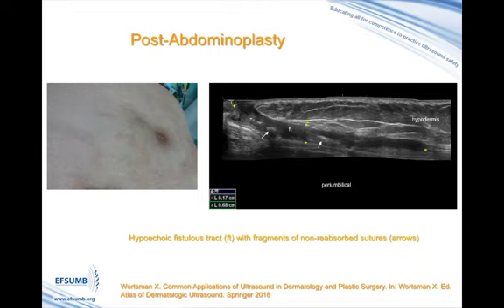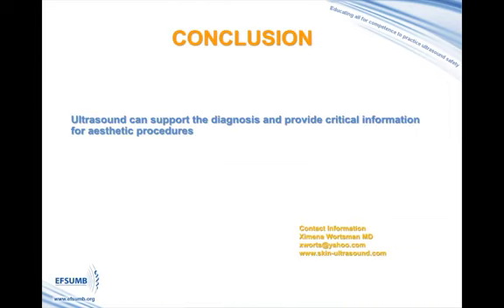In conclusion, ultrasound can support the diagnosis and provide critical information for aesthetic procedures.